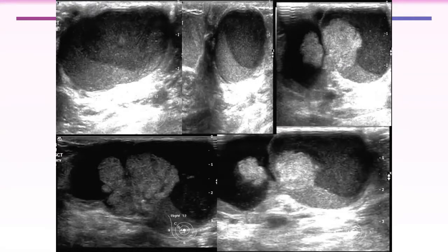Even the cyst component is not just echo-free. It contains different echogenicities. No color Doppler with posterior enhancement, not available here. Color. Okay. It was vascular. Okay.